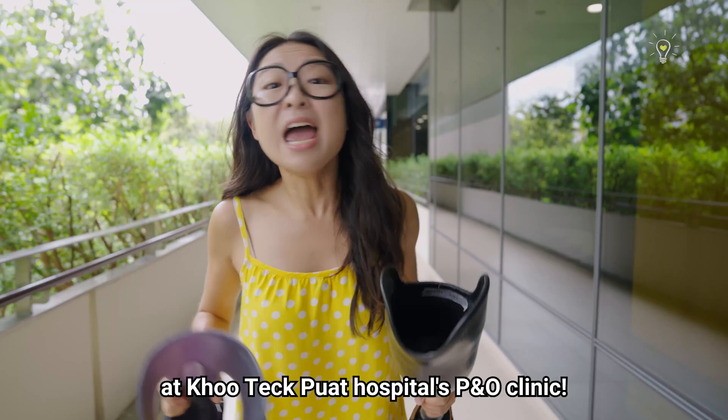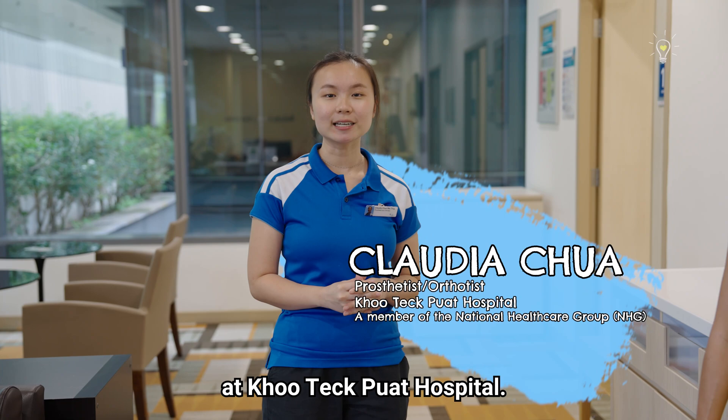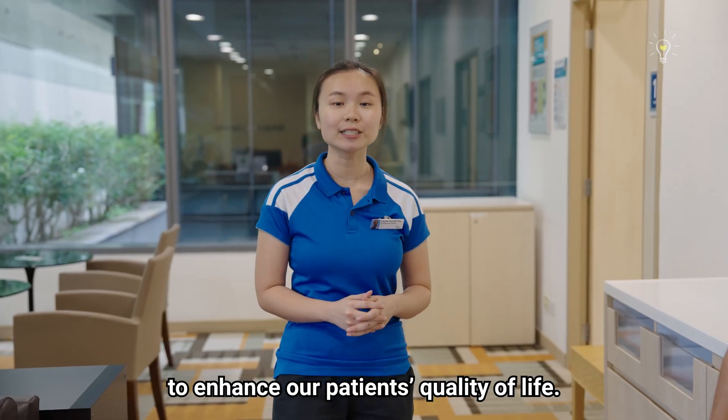So here I am today at Kutekwad Hospital's Ortho Clinic! Hi, my name is Claudia and I'm a prosthetist-orthotist here at Kutekwad Hospital. My job is to design and fabricate medical supportive devices to enhance our patients' quality of life.